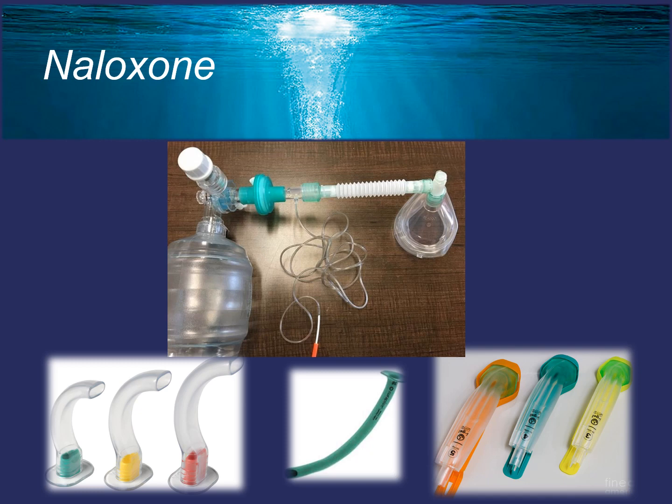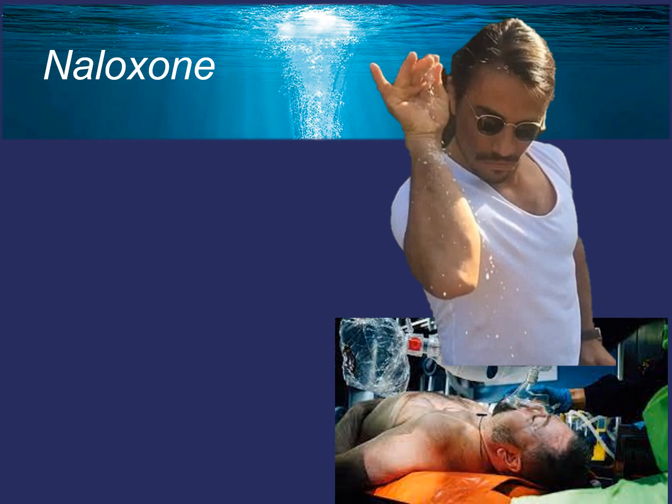A hypoxic brain upon awakening is what causes these combative, confused patients. Administering naloxone in a smaller dose increment, just a little pinch, is just enough to produce effective respiration rates and ventilation. When observing for Narcan effect, the positive end tidal CO2 feedback can be appreciated faster than relying on the visible chest rise, oxygenation, and change in responsiveness.